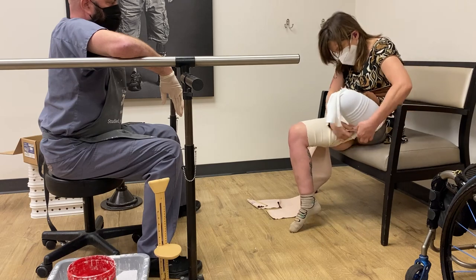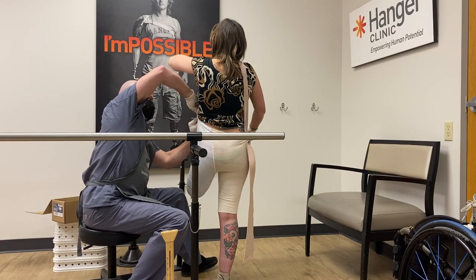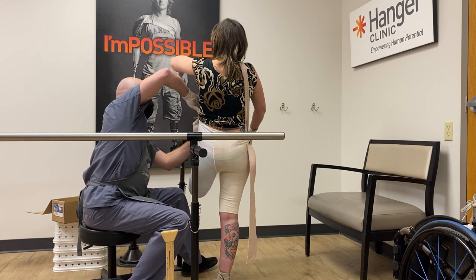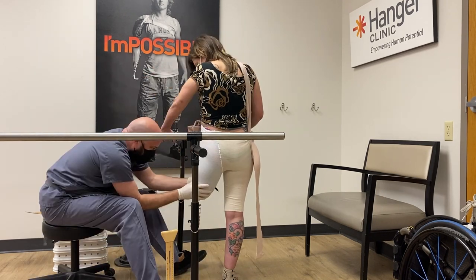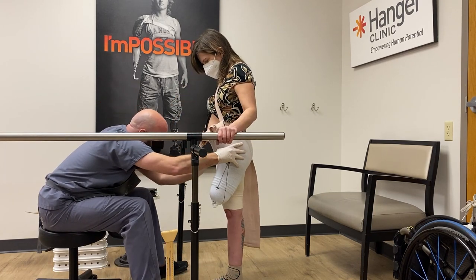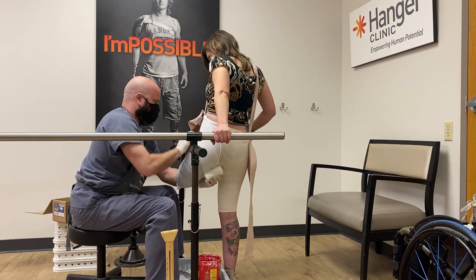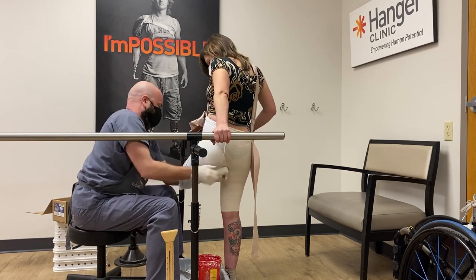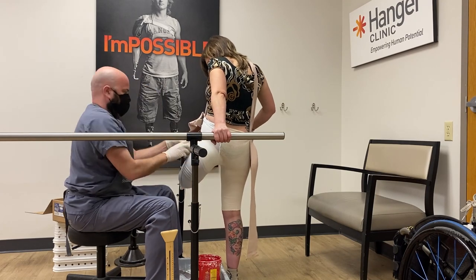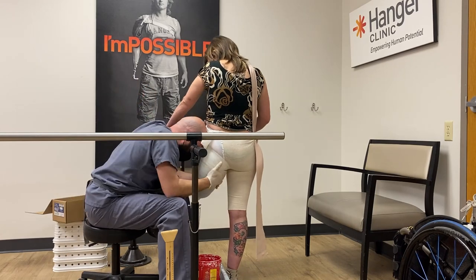Here I am putting on this special fancy pair of pants, and then he is making sure they're as tightly on me as possible. The reason for that is so that the markings he makes on my residual limb will transfer over to the cast that he's taking.